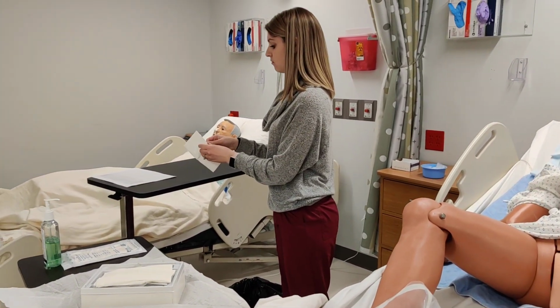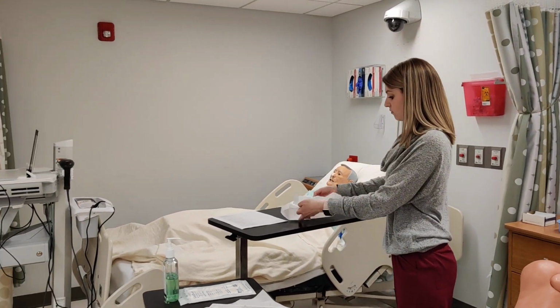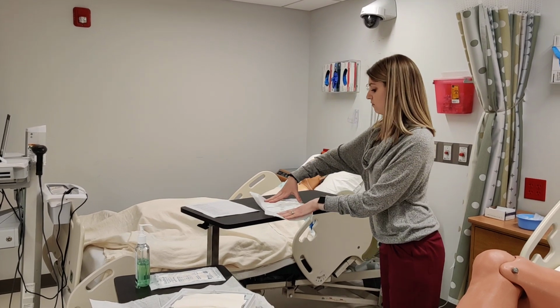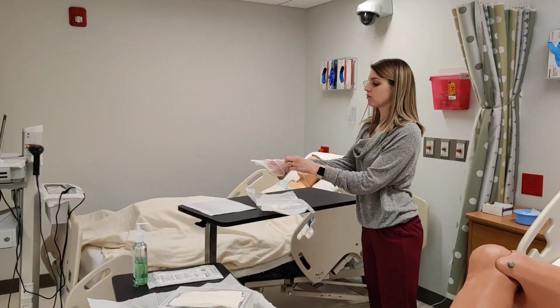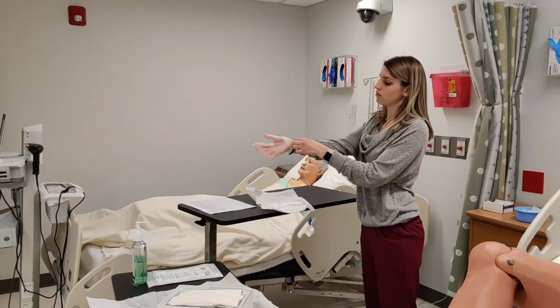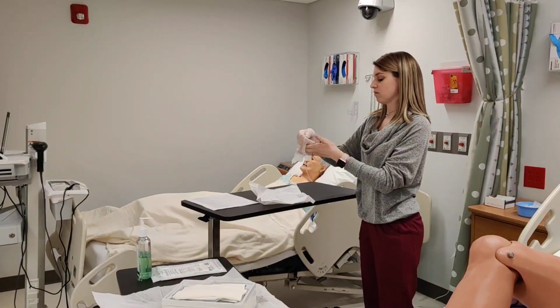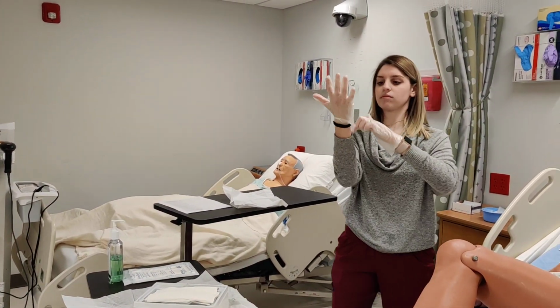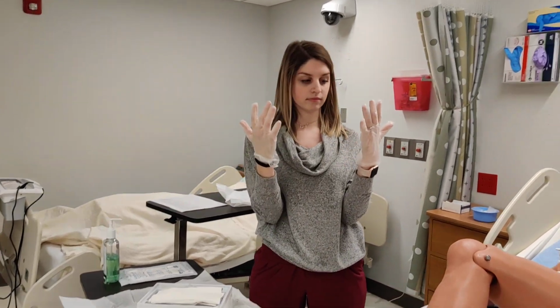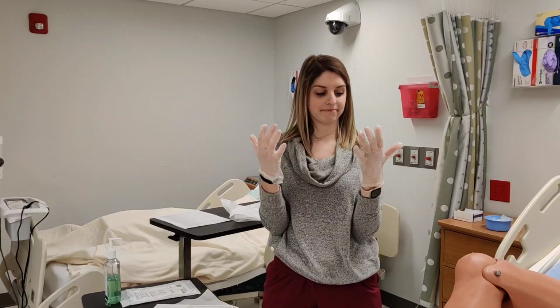At this point, she's going to don her sterile gloves. All right, now that her sterile gloves are donned, just something to add, Gabby is a professional, so she knows how to don her sterile gloves and keep her sleeves out of the way.